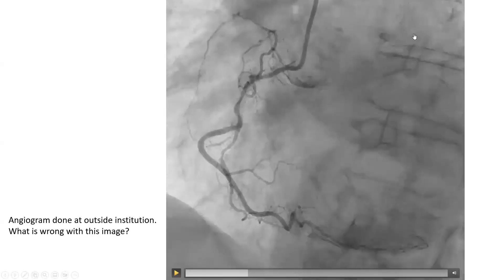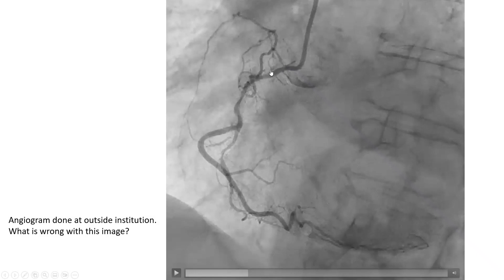When you have damping or ventricularization on your hemodynamics and inject with an occlusive catheter, the contrast will stain inside the vessel — it will hang inside the vessel and eventually stain inside the myocardium. This contrast is not clearing; it sits around in the vessel and in the myocardium and will not get cleared by blood.